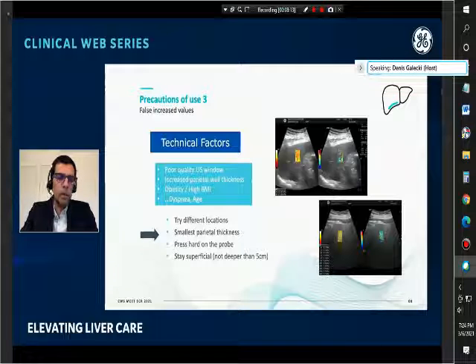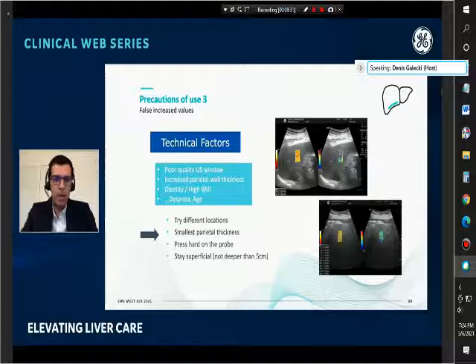And sometimes falsely increased measurements are obvious, like on the top image, but sometimes it's more confusing or delicate, like on the image down. It will just be a few values around 5, others at 8 or sometimes 10 kPa.